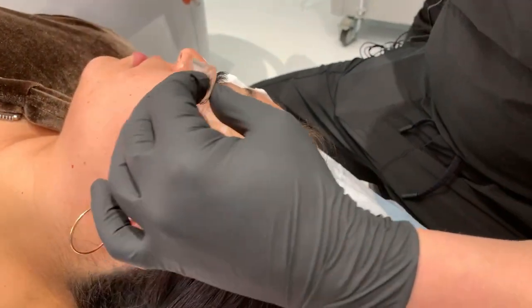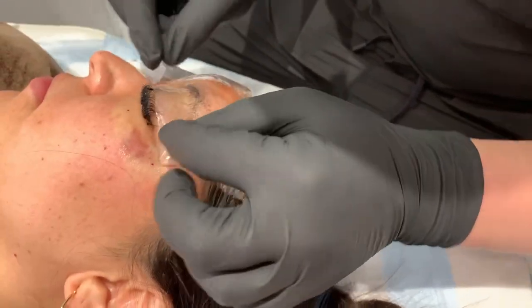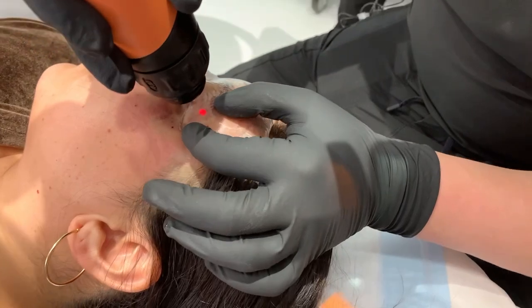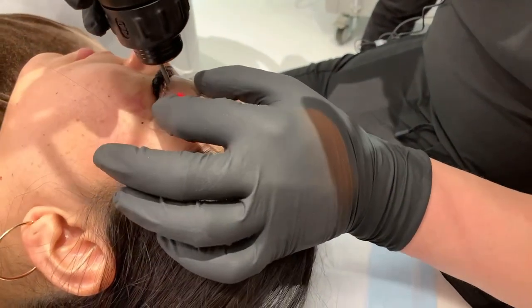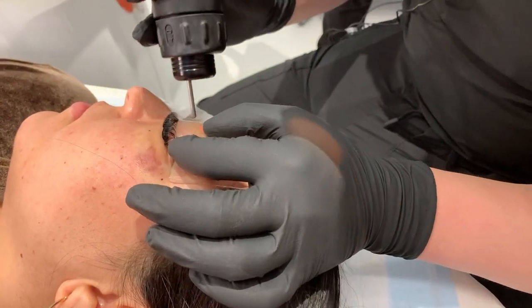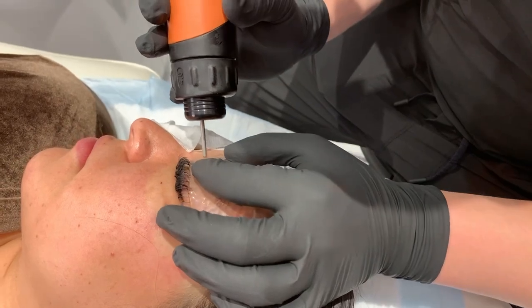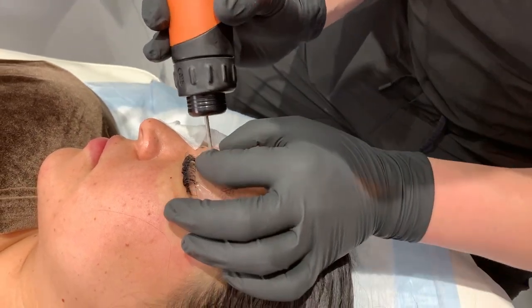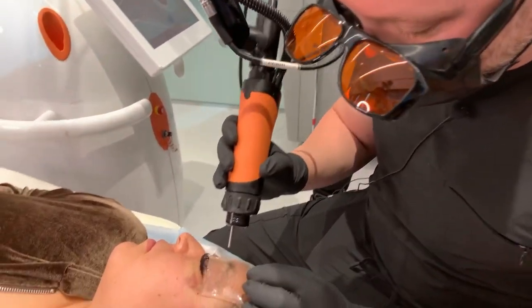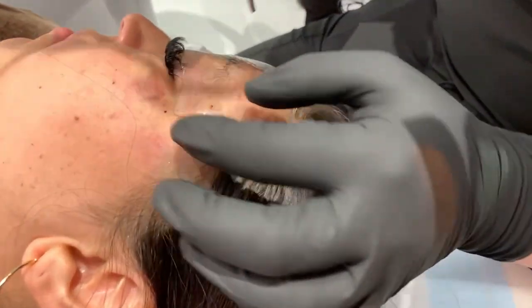We're doing a special technique. In the old days, we used to call it R20. Now we use what's called a PFD patch, which is Perfluorodecalin. And what this does is it allows us to do multiple passes at once so that we can get more of this pigmentation faster. Because in the old days, this would take about 10 to 15 treatments, sometimes never, to even ever fully be able to get this to go away.